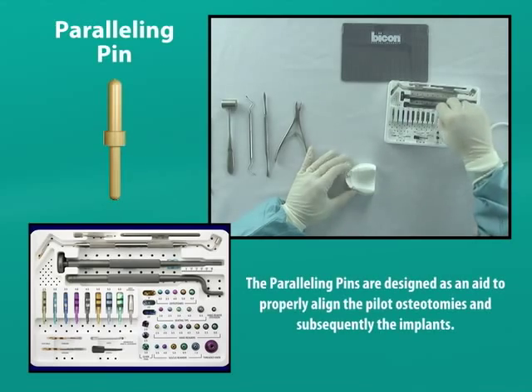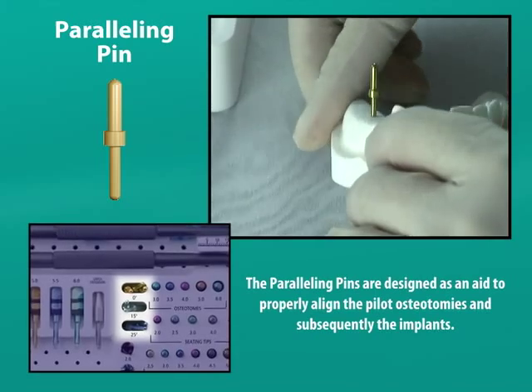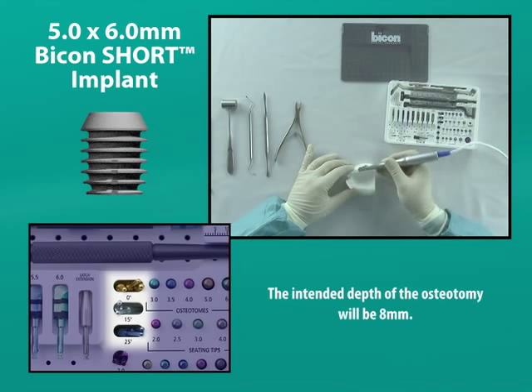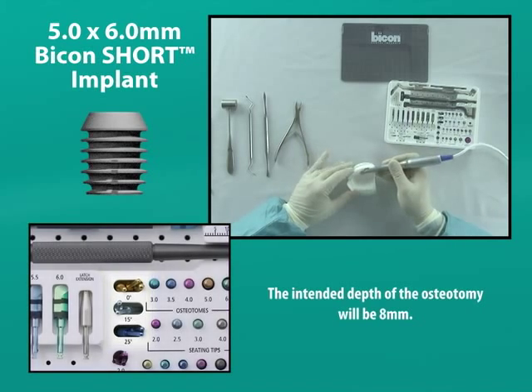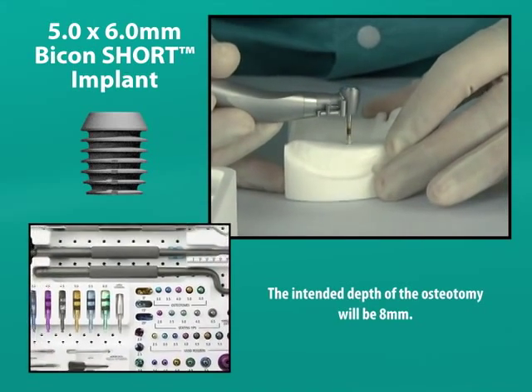Once the pilot osteotomy's location and angulation have been set, we must confirm them with a paralleling pin. In this case, we will place a 5 millimeter wide, 6 millimeter short implant, so the intended depth of our osteotomy will be 8 millimeters.